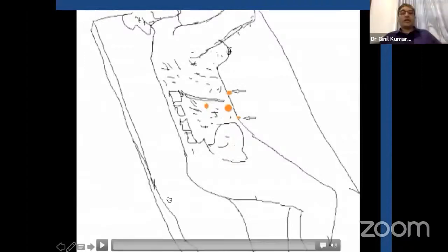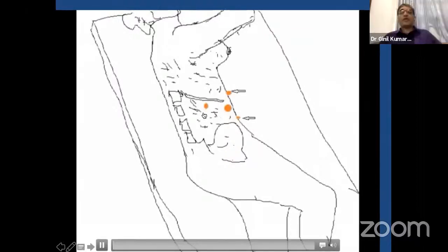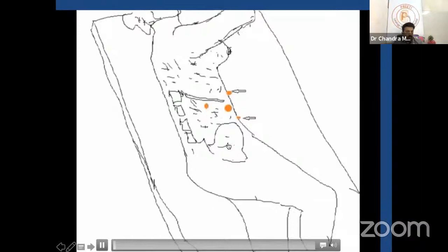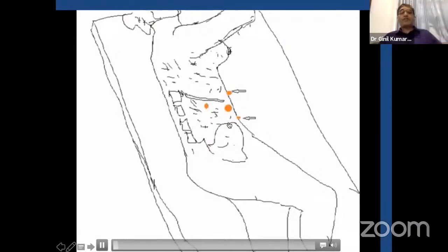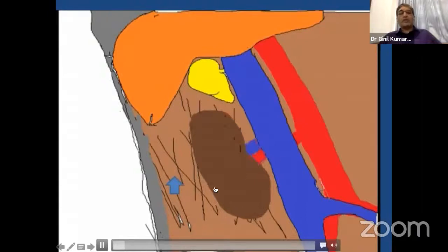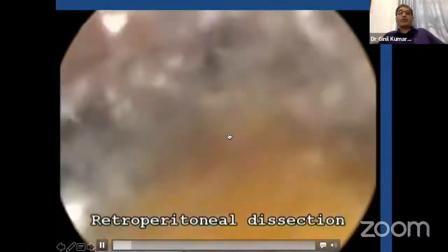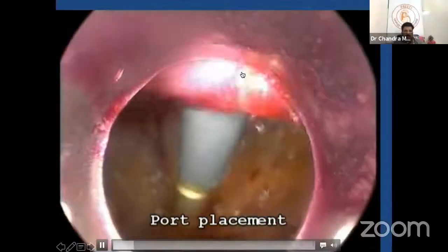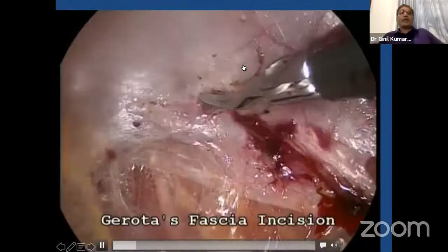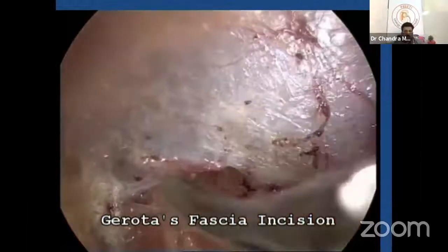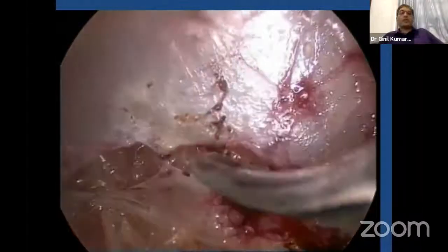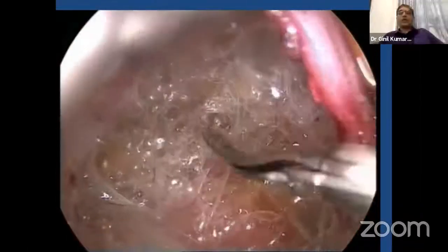I have a small video of adrenalectomy. This is the port placement as discussed. The first landmark: you have to climb on the psoas. Behind the kidney you can identify the renal vessels jutting from the area. You create the space using the camera — just go underneath the musculature, strip off the fat, and identify the peritoneum. The next landmark is the Gerota's fascia. You can clearly identify the Gerota's fascia merging with the psoas fascia, so you cut it. Once you cut, there is loose areolar tissue on which you can just climb.